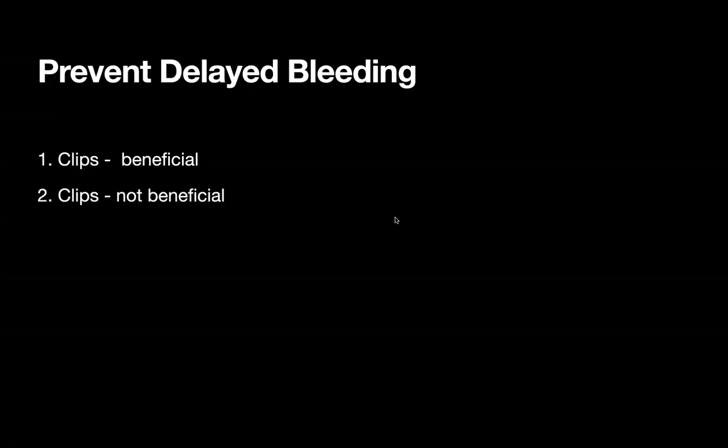And there's also another study when they looked at Medicare payments for clip closure. They felt that if you close a defect on the right side for a large lesion, Medicare would save almost $500 for each case compared to not closing it. Because when the patient comes back to the hospital, goes into the ICU, transfusions, another procedure, when they put all the costs together, that cost is a lot more. So because of those reasons, I think now it makes sense to close.